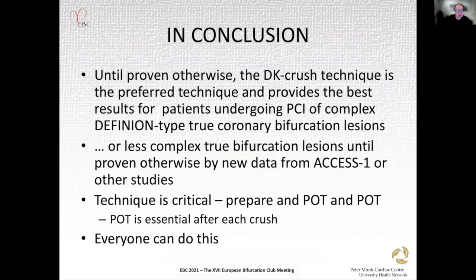So in conclusion, until proven otherwise, Mr. Chairman, panelists, the DK crush technique is the preferred technique and provides the best results for patients undergoing PCI of complex definition type true coronary bifurcation lesions or less complex true bifurcation lesions until, again, proven otherwise by new data from other studies. Technique is critical.